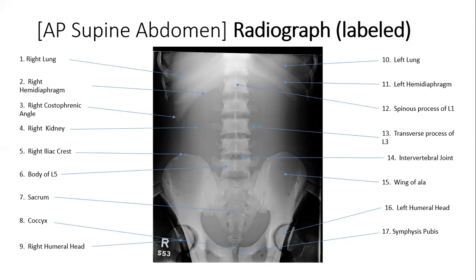This demonstrates how we should position our patient for an AP supine abdomen and what is needed to successfully get this image. Thank you.